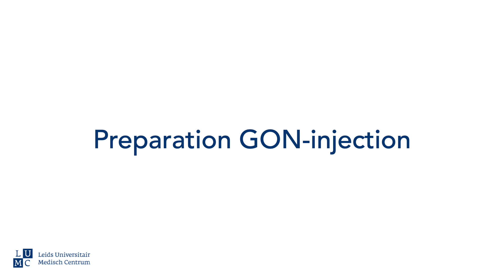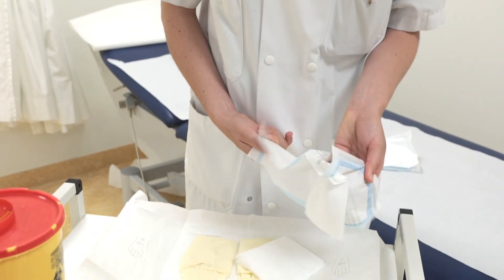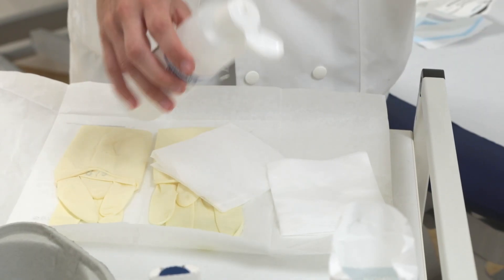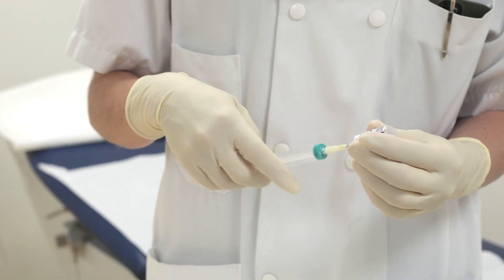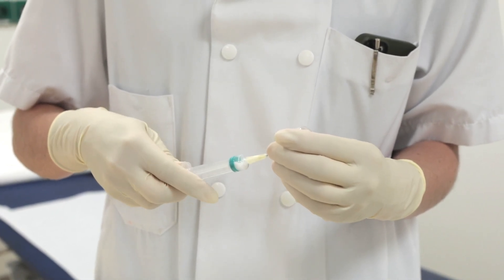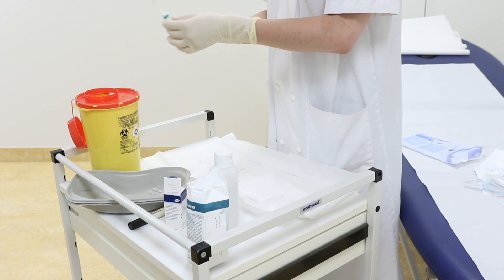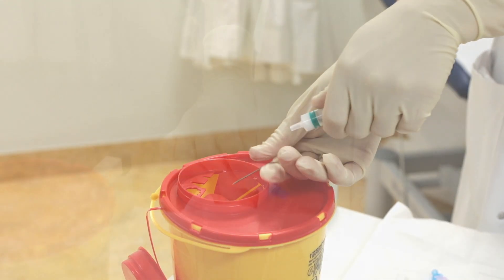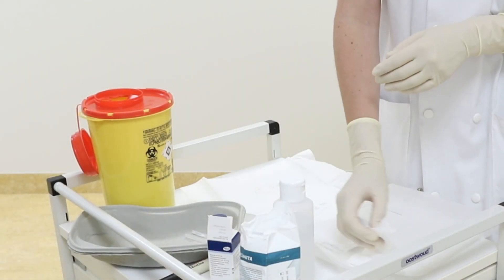Next, prepare the injection. Unpack the sterile gloves and turn the package into a sterile field. In the sterile field, prepare two sterile gauzes, one with alcohol and one without, the pull-up needle and the injection needle. Put on the sterile gloves. Draw up 2 cc of the fluid so that a total of 80 mg of methylprednisolone and optionally 20 mg of lidocaine enter the syringe. Remove air from the syringe, then safely discard the pull-up needle into the needle container, and place the injection needle on the syringe. Disinfect the injection site one more time.